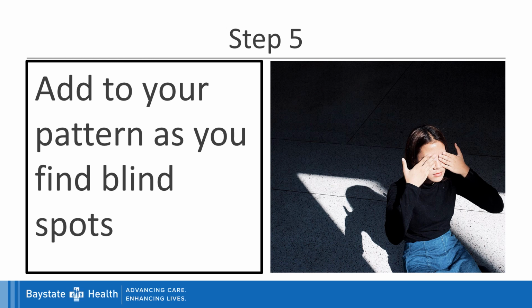And with that, I will summarize that you should have a 5-step approach to reviewing and establishing a search pattern as you go along. We talked about making sure that you are looking at the appropriate study, make sure that you are familiar with the anatomy before you start to establish your search pattern, create a search pattern, and always stick to it. Do not vary it. Recognize that there are differences in search pattern depending on individual and the study itself, and add to your pattern as you go through your career.